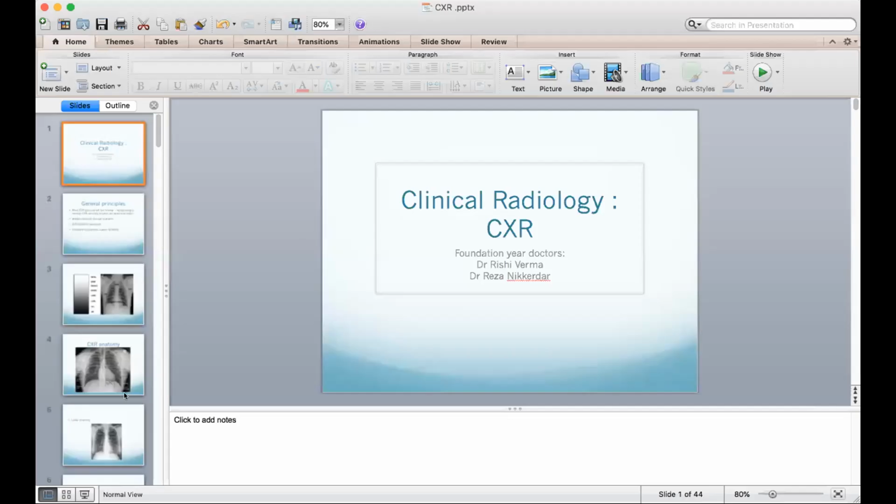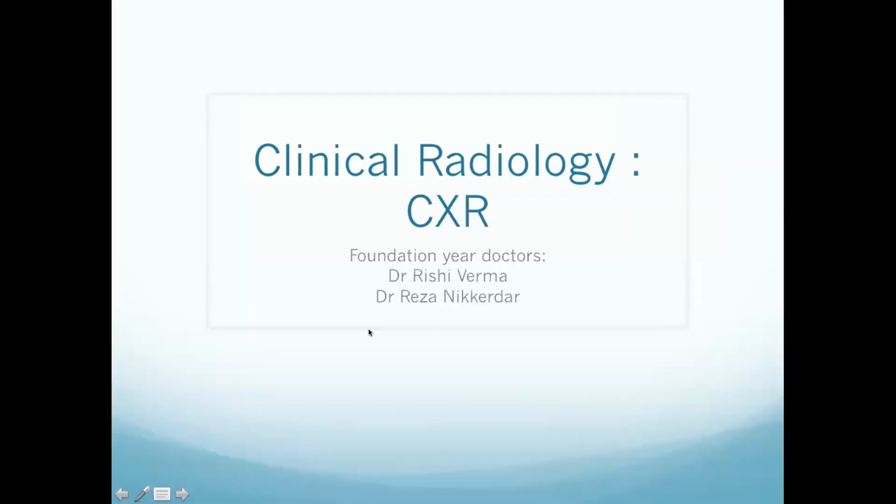Hello everyone, my name is Rishi. I'm F2 currently on radiology. Let me just share my screen. So this is going to be sort of in 2 parts. I'm going to do the first part. I'm just going to go through how to basically interpret an X-ray, just key things to look out for. And then Raz is going to do the second part. He's going to go through some clinical cases, all the main ones, the more common ones that might come up in exams and also when you're in hospital as well.